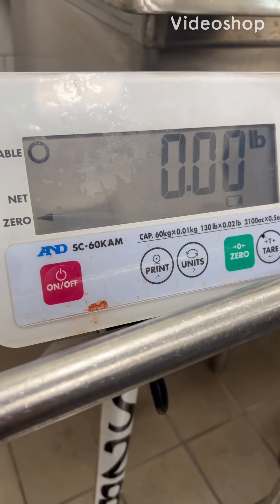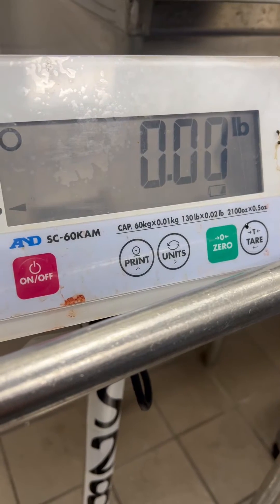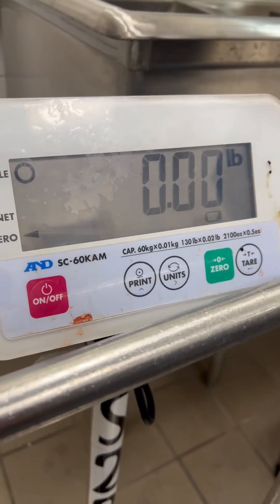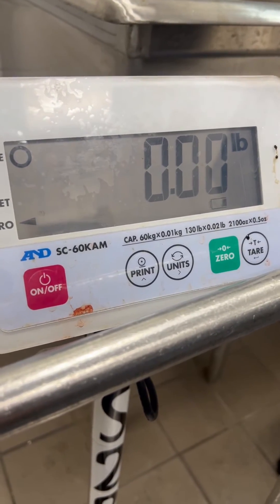This is a calibration adjustment of an A&D SC series. In the manual it says to hold down the tare key for about three or four seconds until you see the gravity digits. I held down the tare key, nothing happened.